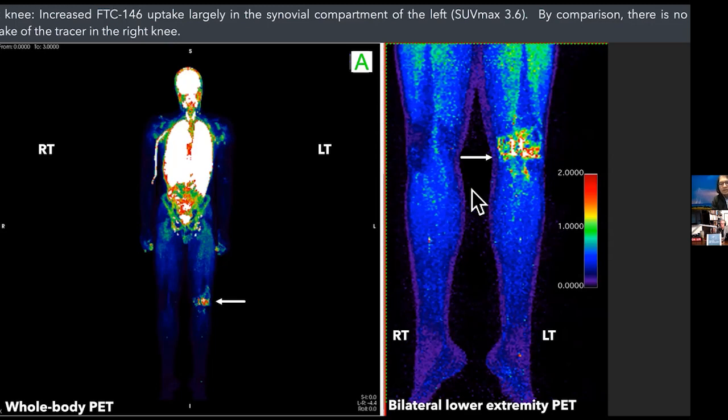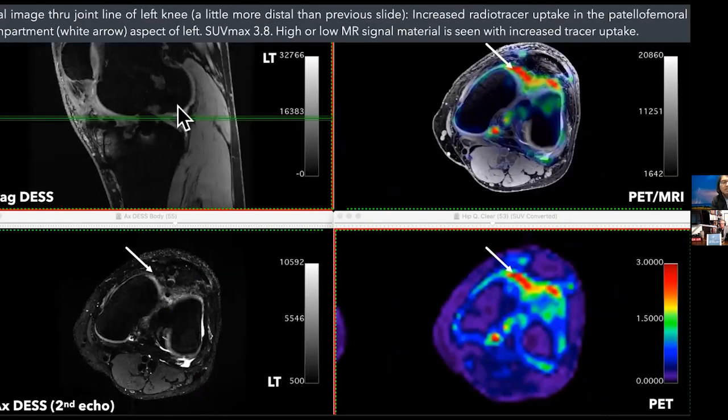Again, just to reiterate, the patient had 2 MRIs prior to this that were read as essentially non-contributory, meaning they were just post-surgical change, but nothing particularly painful specifically. And here's some PET MR images. This is a sagittal, so we're kind of looking from the side. This is what's a transverse image.